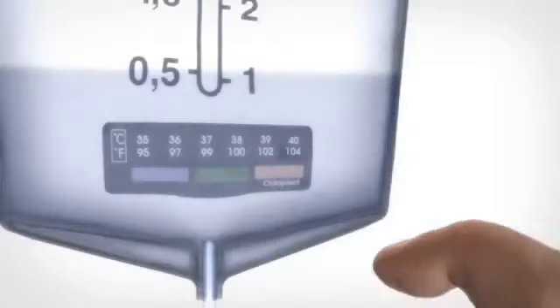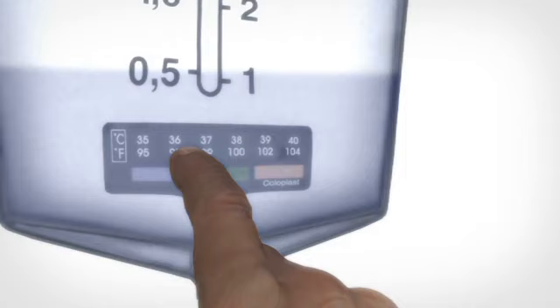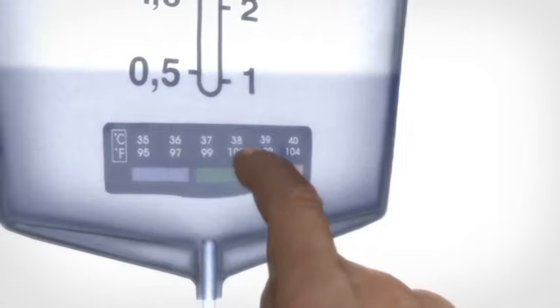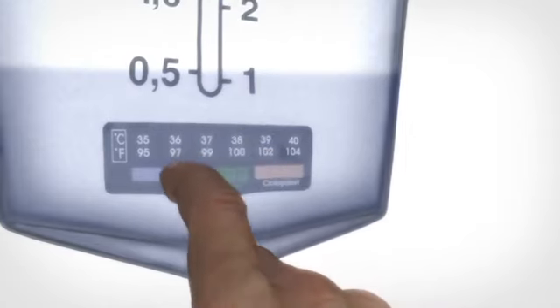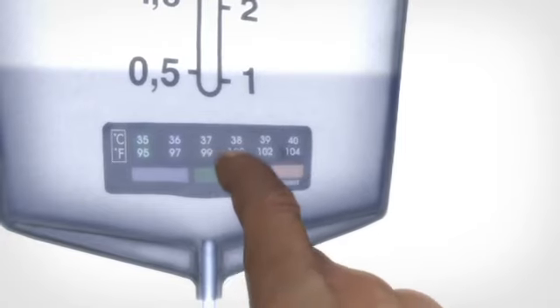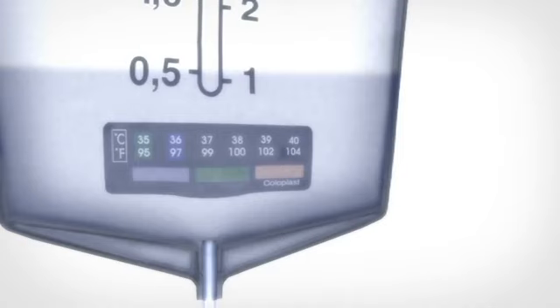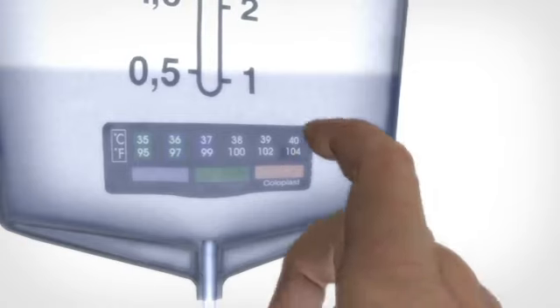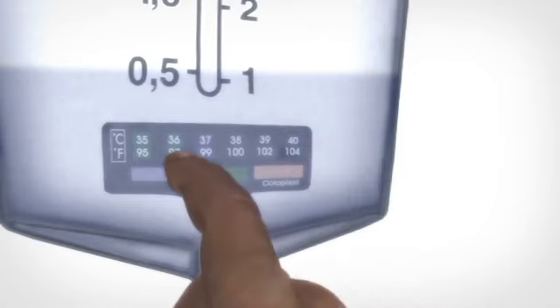The temperature of the water should be between 36 and 38 degrees Celsius. This corresponds to 97 to 100 degrees Fahrenheit. Correct temperature of the water is indicated by a mark. Regulate the temperature of the water until the reading is between 36 and 38 degrees Celsius.